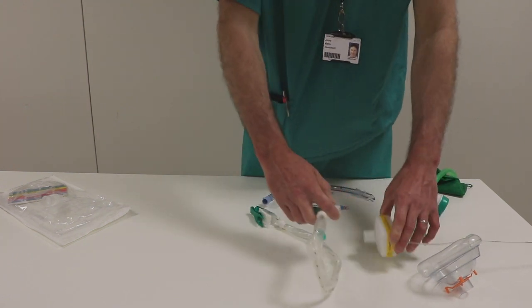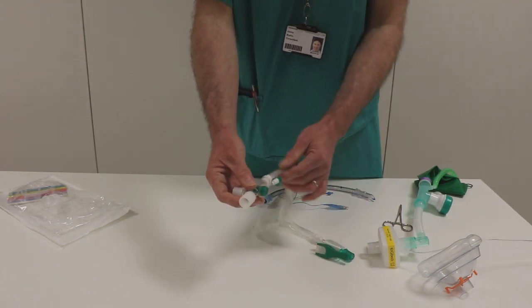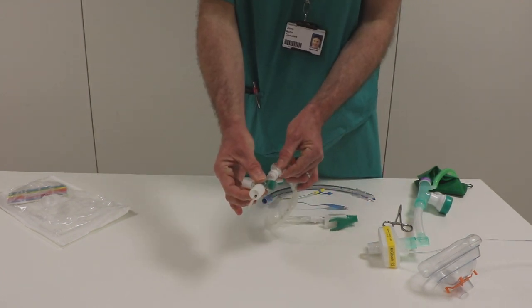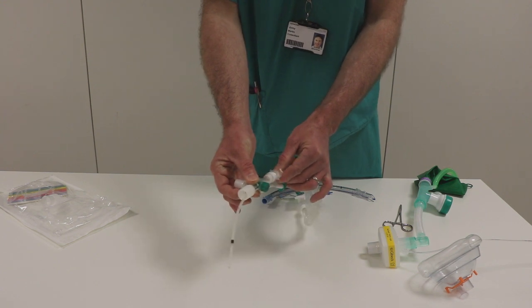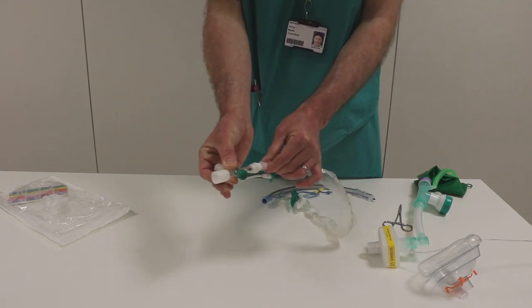I'll talk you through some of the points of this piece of kit. It's used to pass this suction catheter down into the patient's airway. It's pulled back and forward like so, and you can see it's in this protective bag.